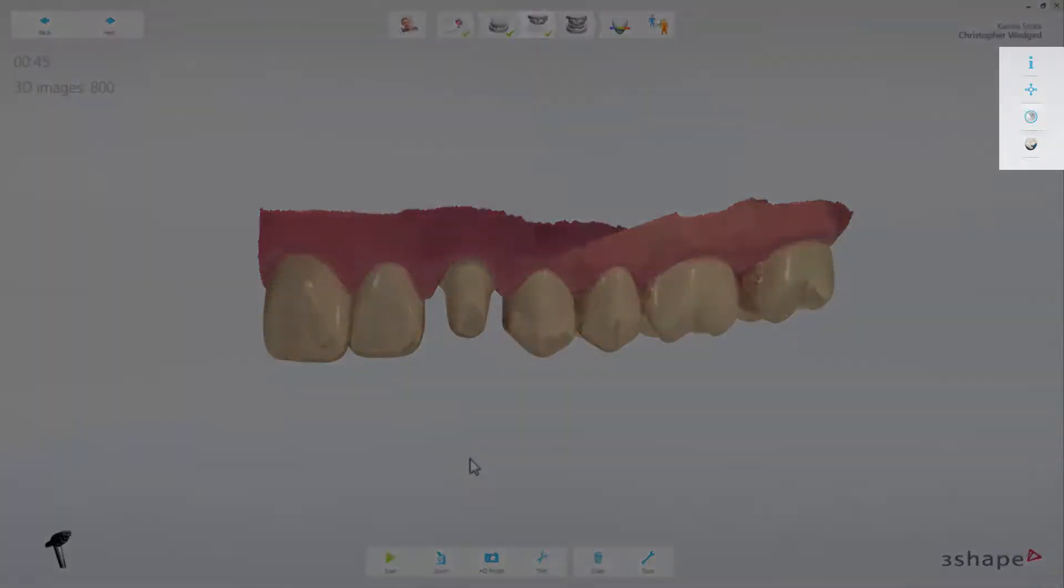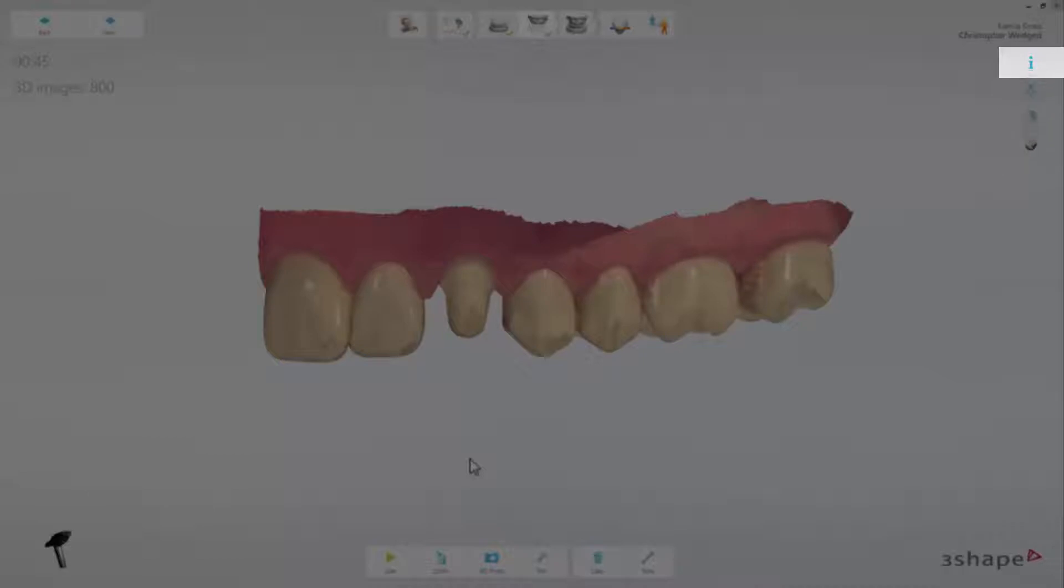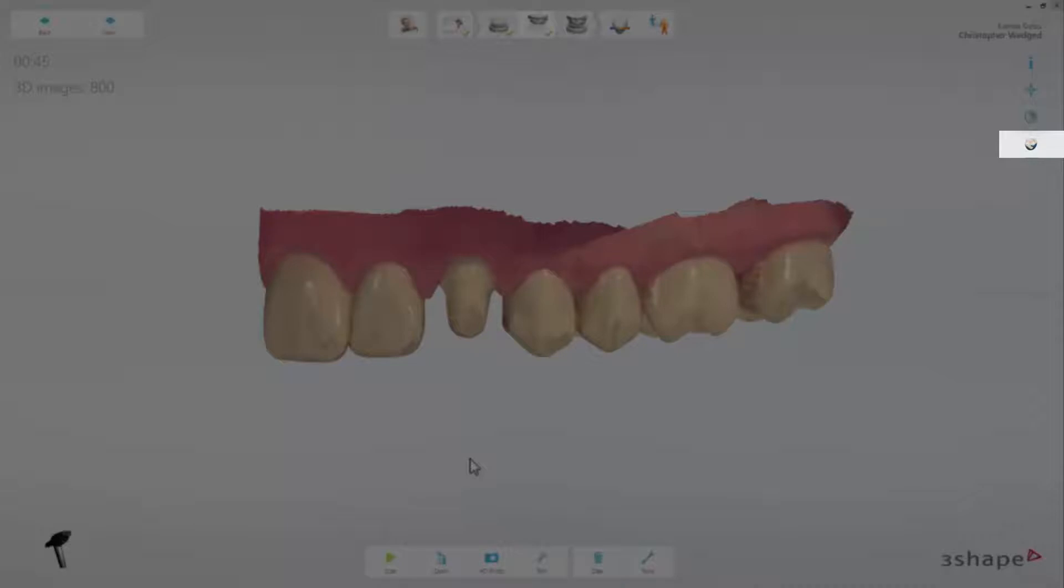On the right side of the screen, you will find the visualization toolbar. The buttons in the toolbar allow you to find information for the particular step in the workflow, which are the scanning tips page, change the model viewing modes, enable and disable color mode, and the last option is to check the quality of the colors for shade measurement.